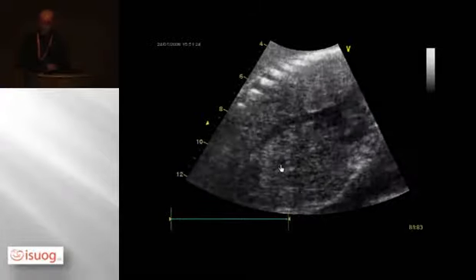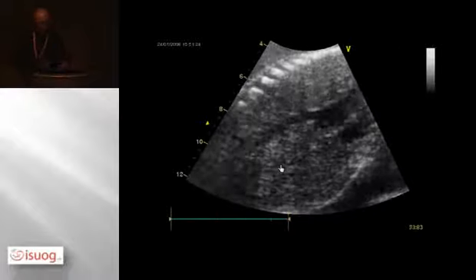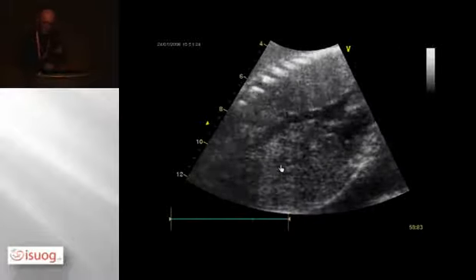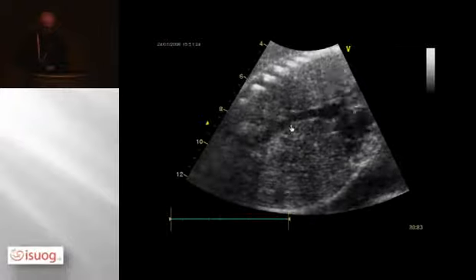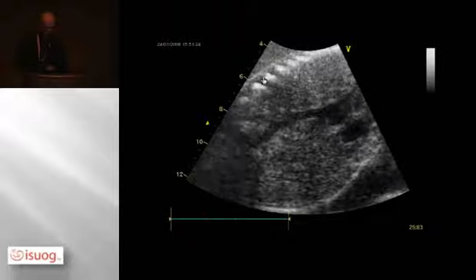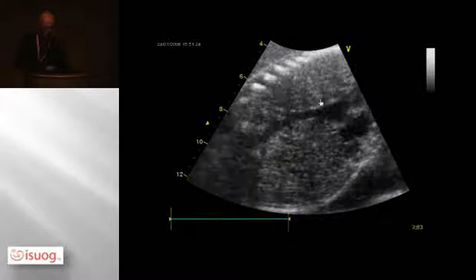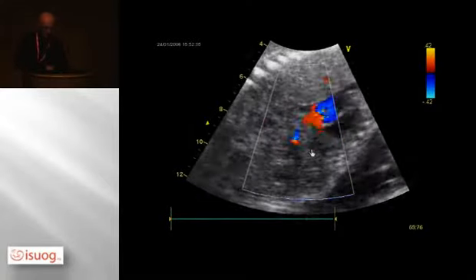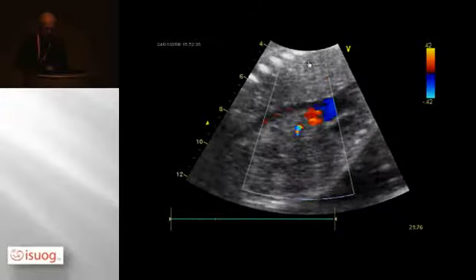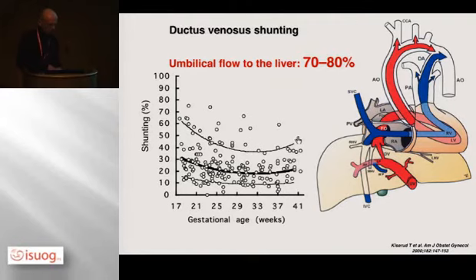The other possibility is going from the opposite side if the baby turns the back towards you. From a classical point of view, that should be the very best, because then you have the velocity towards you, which is usually the better signal than that which goes away from you. But in this situation, you can see maybe the IVC, the atrium, and you have now run all the way up the spine on the level of the heart, or even above it, and then you're looking down here because you expect it to come here. And then you put on the color, which you don't see, and you get a perfect insonation here. If you now insonate here, there will be nothing to correct. And then you get it. So that's what you use then. And then you get the pulsatility.